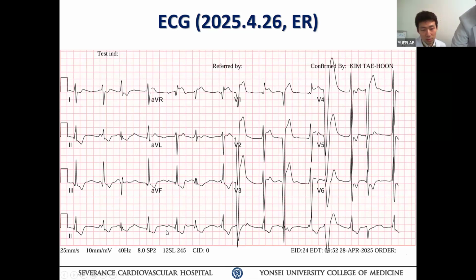So yeah, this is just AV dissociation, and the PP interval is not regular as well. So I think there is no AV association and four different wide complexes.